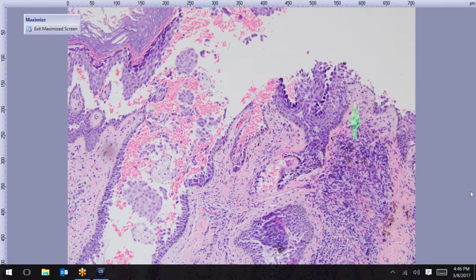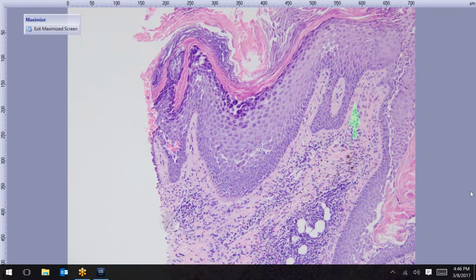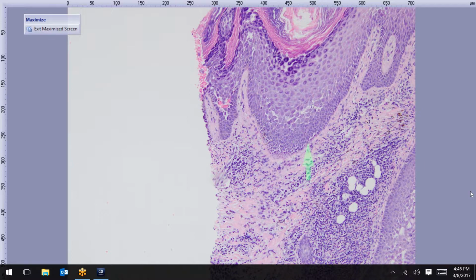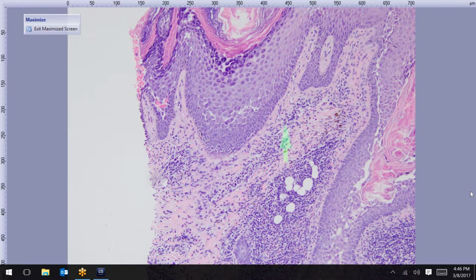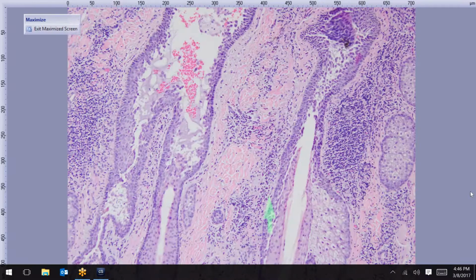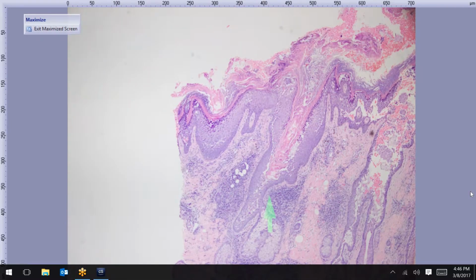However, this was not ultimately pemphigus vulgaris, and this was really Hailey-Hailey, where you get almost full thickness acantholysis in some of these areas. It just happened to interestingly have a lot of follicular involvement. They had the typical classic presentation of Hailey-Hailey in the folds and everything.